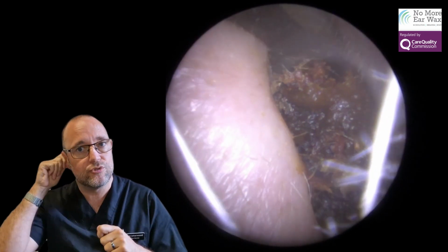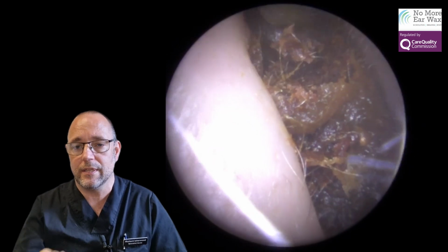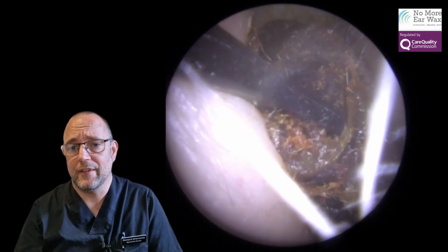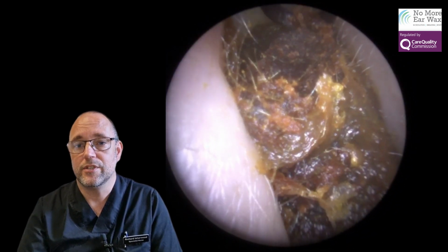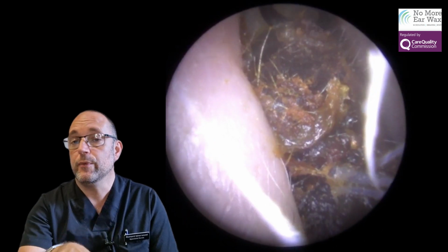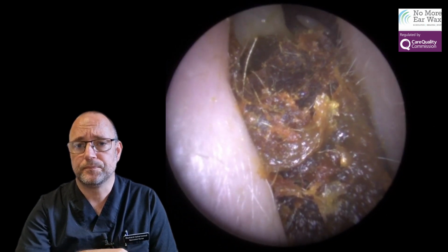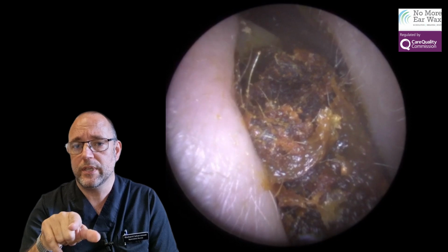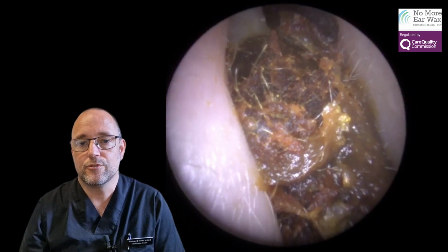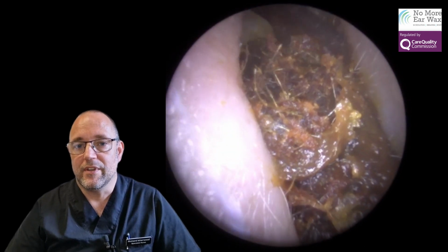So we did try and stretch it open, pulling it like that to get it out with the suction, but it was proving really difficult. It was really hard. The core of it was quite hard. As you can see, the top layers here are quite soft and gooey, which is why I've gone in there with the trusty Jobson horn, and I'm trying to scoop in just behind it, and it's filled the whole canal as it is now. So I'm just trying to roll it forward, if anything else.